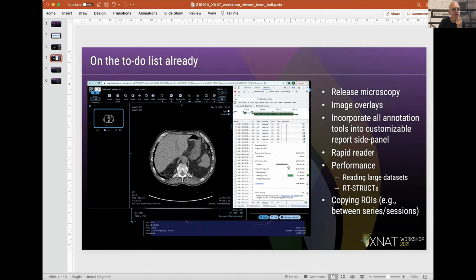Even when it does start getting processed, you're waiting for this really quite long length of time, and then the actual content download is actually very short. And so repeat requests are really inefficient for doing these things. We need to try and figure out quicker ways of getting data into the OHIF viewer, and so that's going to be a big focus of some of the stuff we do in future.